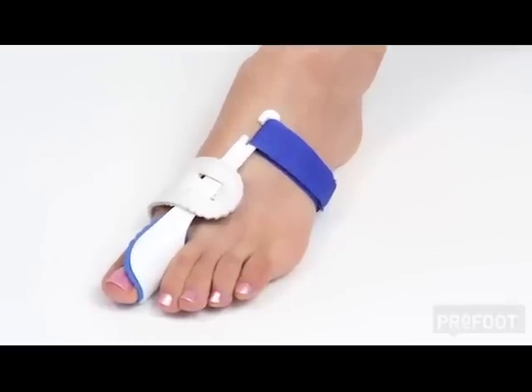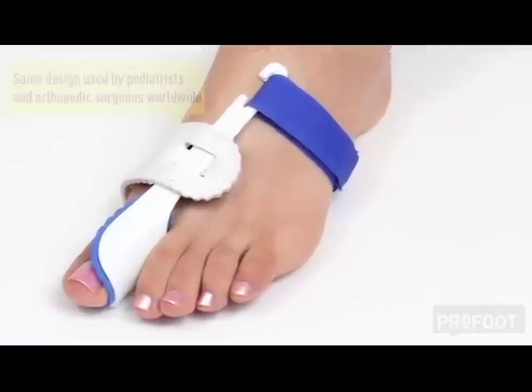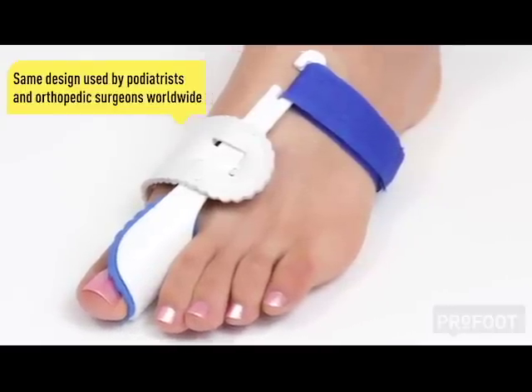Comfortable, safe, and highly effective. The ProFoot Goodnight Bunion is the same design used by podiatrists and orthopedic surgeons worldwide.